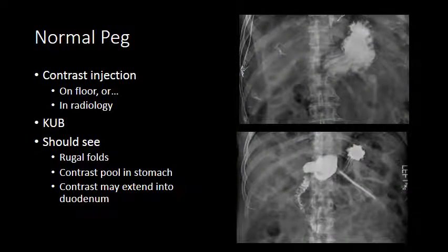Here are two examples of normal percutaneous gastrostomy catheters after contrast injection. We can see a normal rugal fold pattern within the stomach, pooling of contrast within the fundus, and in the lower example contrast extending into the duodenum. While this gives confidence that the gastrostomy catheter is in the right position, sometimes malpositioned gastrostomy catheters can still fill the stomach due to a mature track when the catheter is in the track but does not extend all the way into the stomach itself.